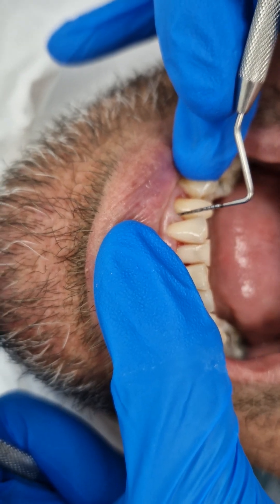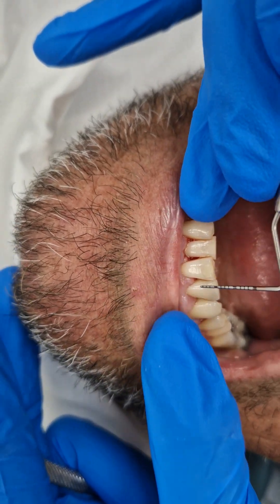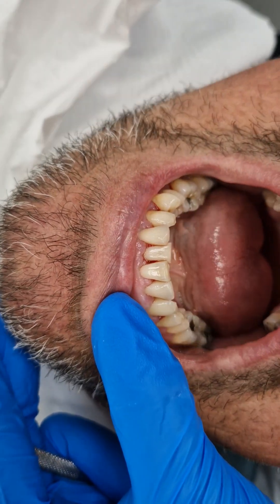We've cleaned under it today with the ultrasonic. The hygienist can use a bit of anaesthetic if the gum's a bit tender, or try without. It's basically just really cleaning under these pockets and getting them to reattach.